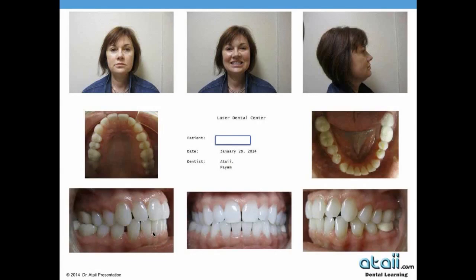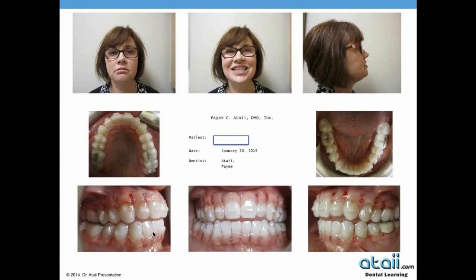In her particular case, after the aligners were shipped to us, we simply started by putting on the attachments. You can see we introduced the Propel right in between the roots of the teeth, and I simply had her start with the aligners, and she's changing the aligner every week. So January we started, she got propelled in that same month, and at the end of the month, aligners with attachments went on. And this is a first visit.